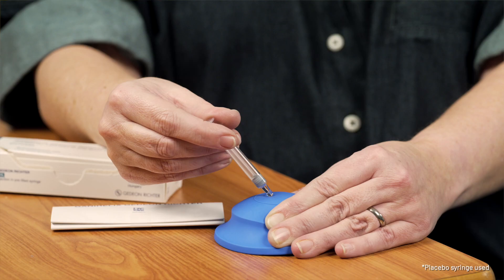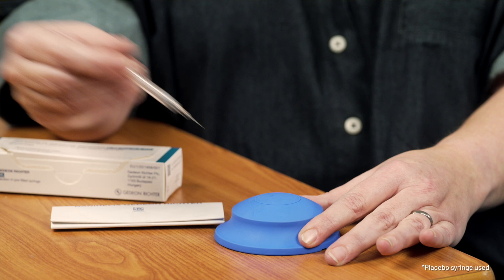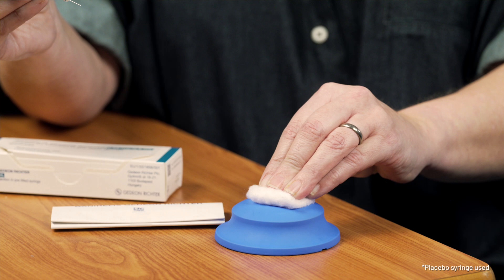After you've completed the injection, count to five slowly, then let go of the skin you are pinching and pull up the syringe quickly, and then apply pressure to the injection site with a cotton wool ball — but don't rub the skin.